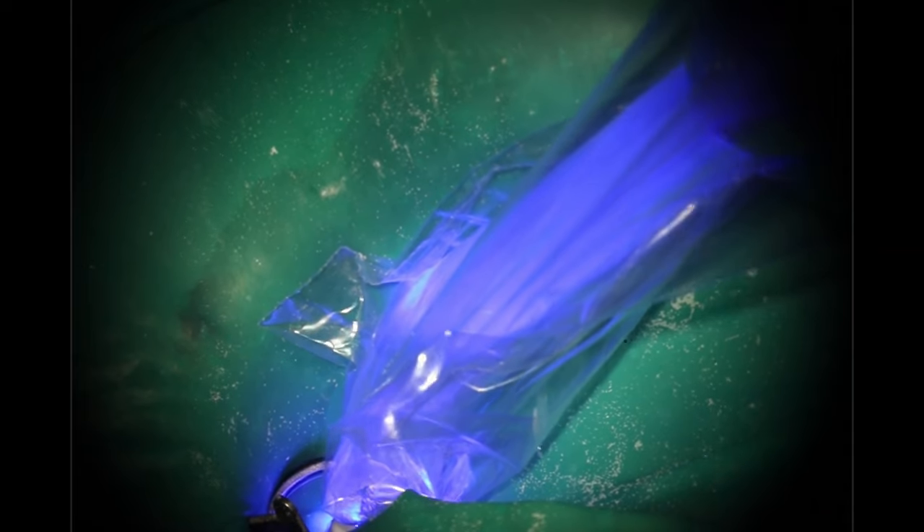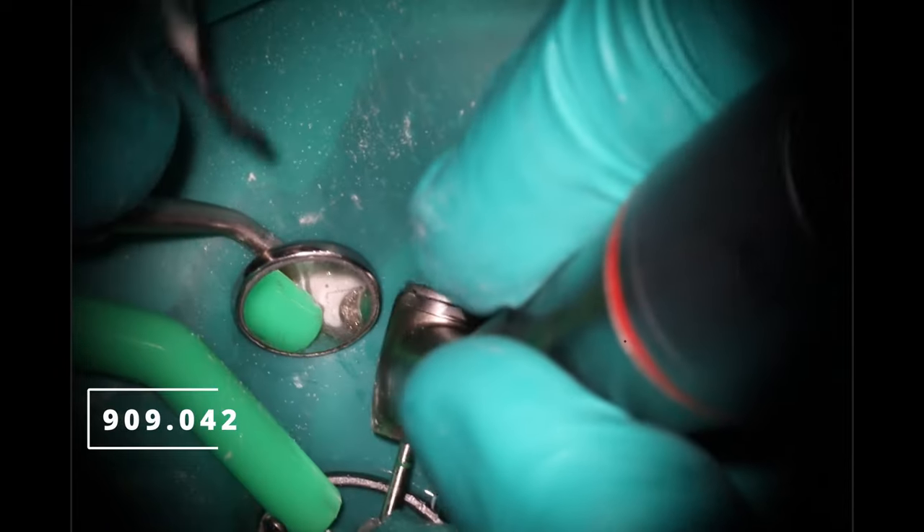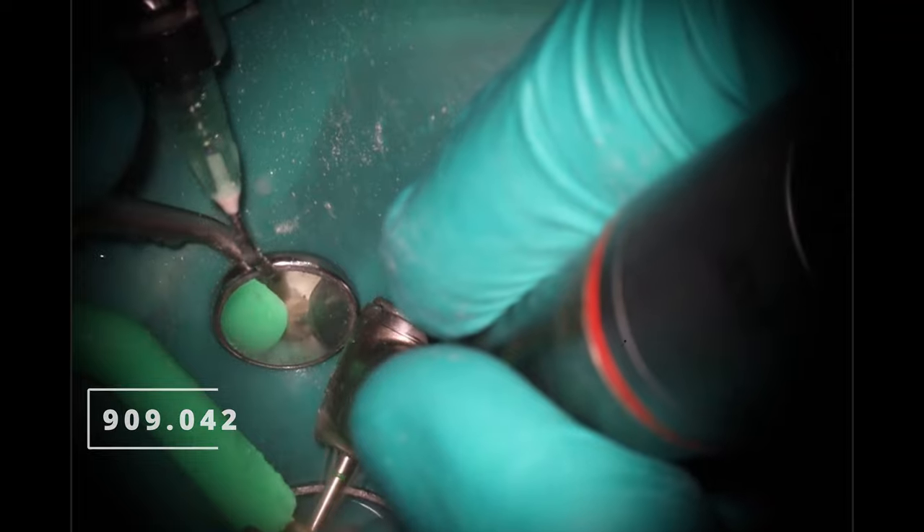During this point when I'm working on the Glick, what are you doing? I'm cleaning up the composite gun and getting ready to hand you the curing light. And so at this point she's already handed me the curing light. That hand switching — Jenny is now holding it because what I'm doing on my side is switching out the burrs for my high-speed hand pieces, because I know I'm going to be using the flat disc, the prep burr, and the barrel burr. By having those ready to go, I don't have to waste any time switching them out. Try to use moments where you know there's going to be downtime — like during light curing, or etching, or waiting for something to dry — for that to be the time when you do stuff on the side.